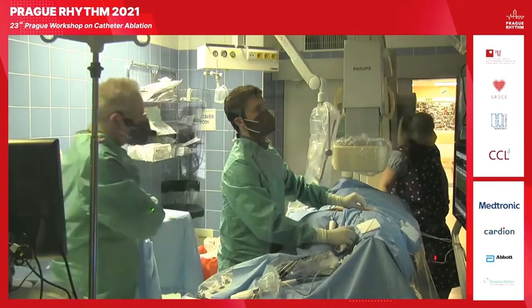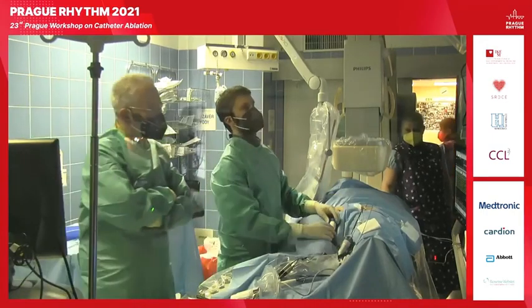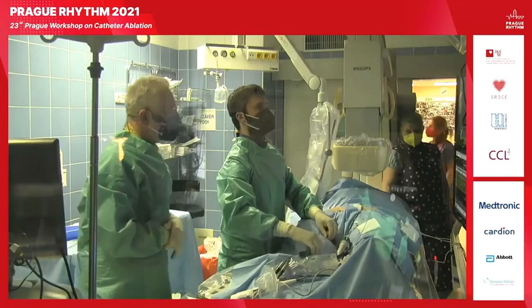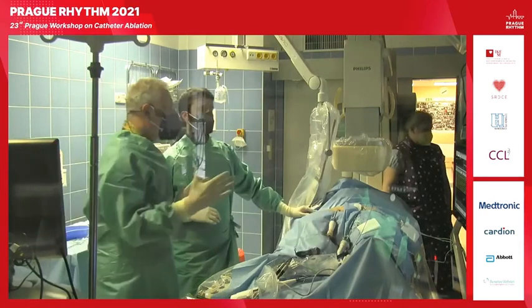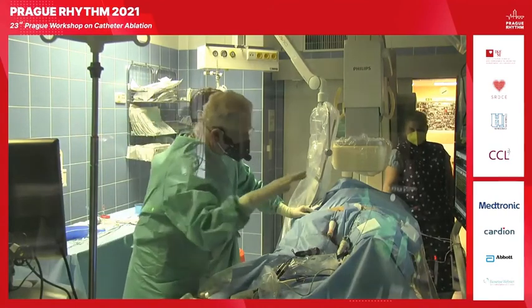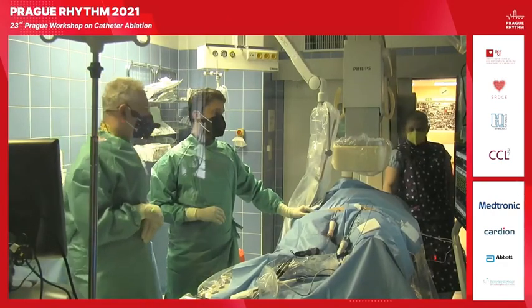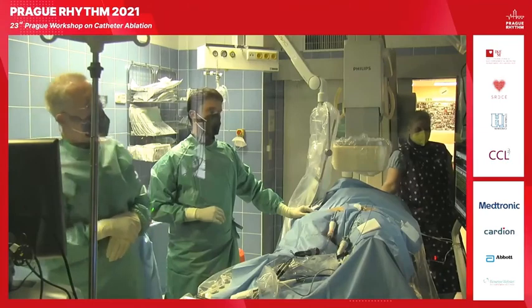So actually usually when we have troubles with esophagus, we have sometimes problem to isolate the vein when we play, and actually we are limited by positioning of the laser beam. Sometimes we need to go too much inside, sometimes we need to go way outside to avoid all this esophageal heating, because our cutoff limit, or the upper limit, is 38.5 for laser, 39 degrees of Celsius. Okay, so this is my answer. I don't know if you are satisfied with that.